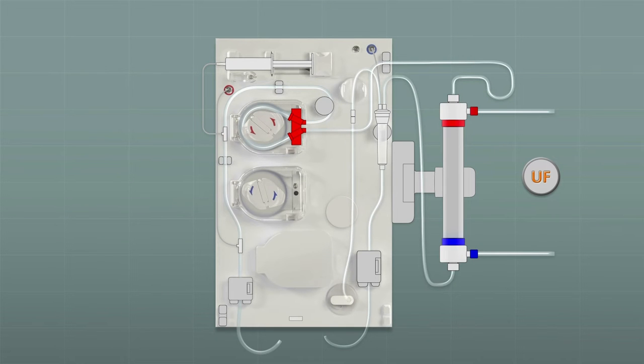The overflow line is attached to the drain port. The arterial and the venous line are connected.